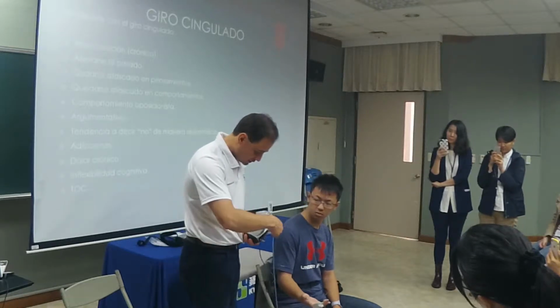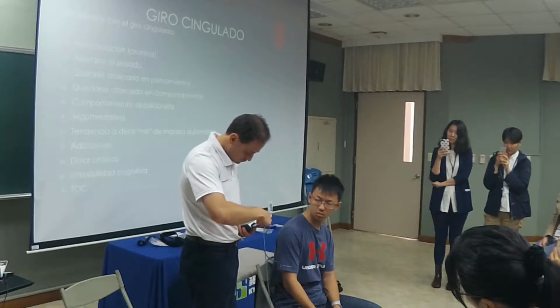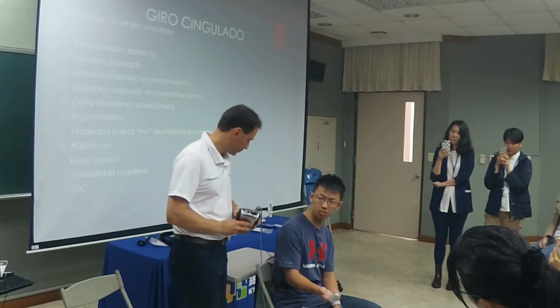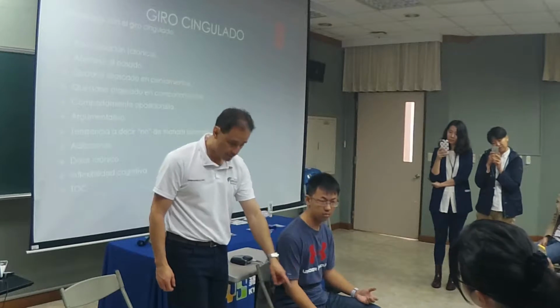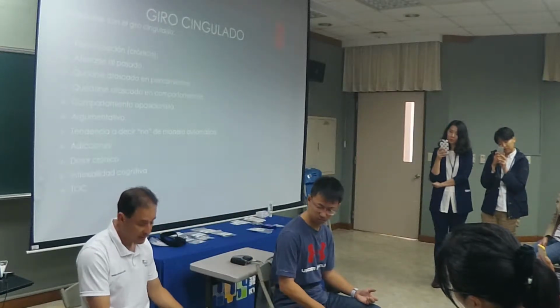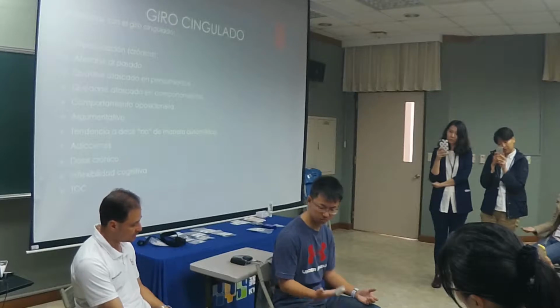Again, it goes into the next channel, the G channel. And the same thing: red dot with the red dot. Very simple. Now you place your hand above your left like this. Why like that? Because if you put it down, it's adding pressure to the sensor, so it's going to cause some noise. We want to minimize this noise as much as we can.